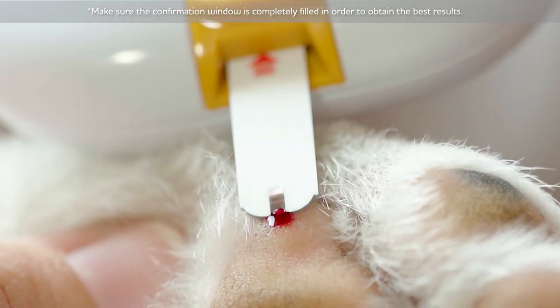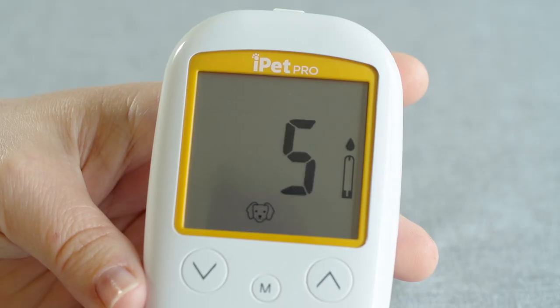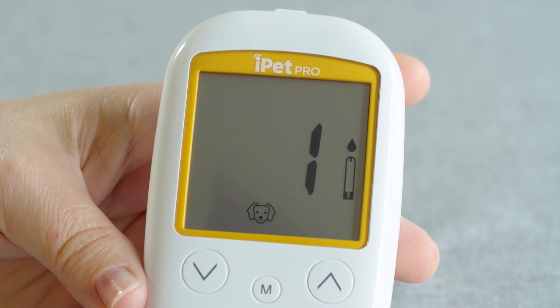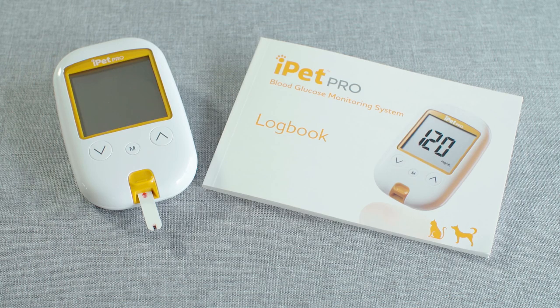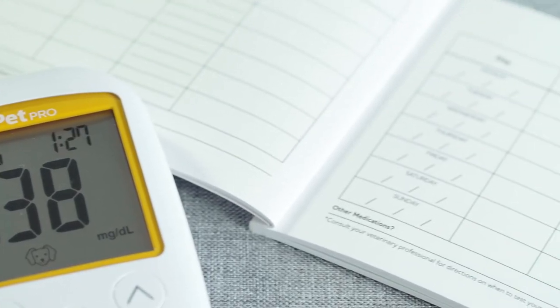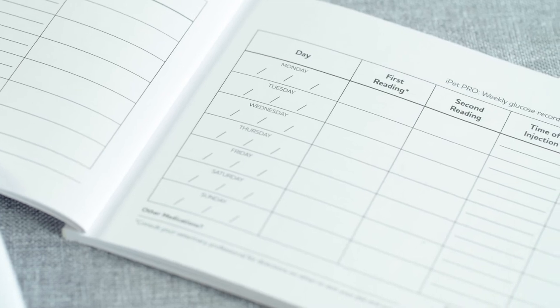To obtain a blood sample, place the test strip against the drop of blood, being sure to fill the entire test strip confirmation window. A beep will confirm the analysis has started. Results appear after 5 seconds. It is important to record all information pertaining to your testing routine as outlined in your logbook. This information should be shared with your veterinarian.